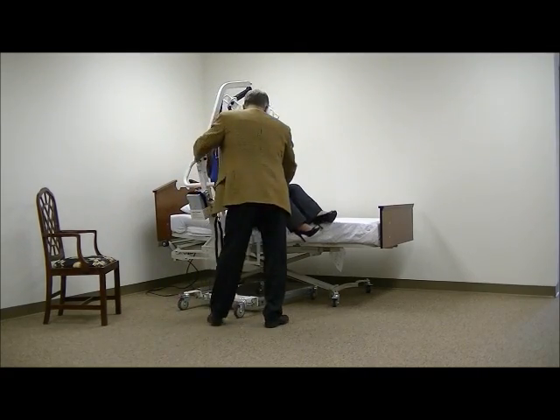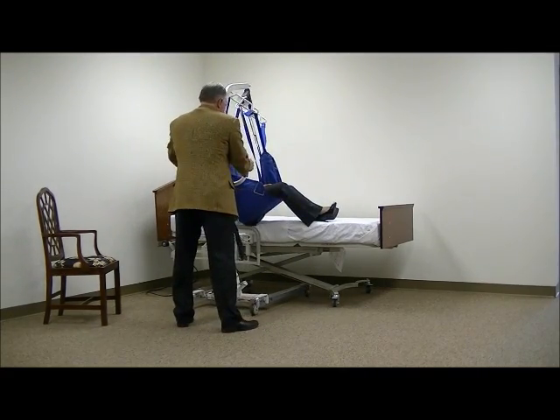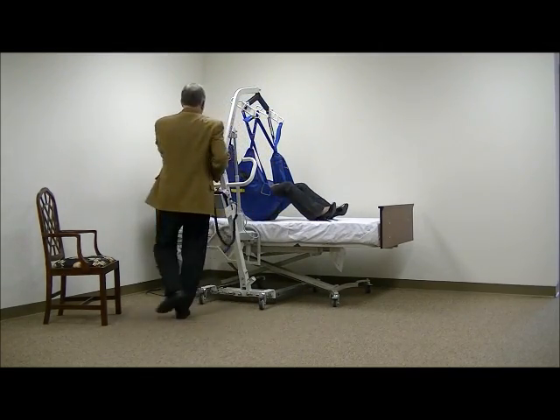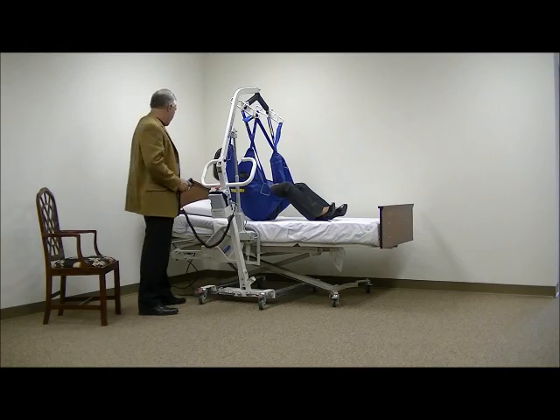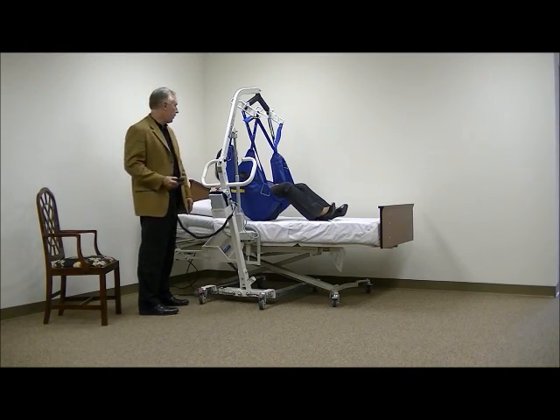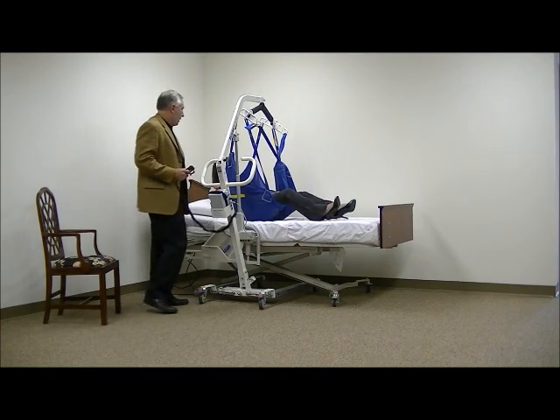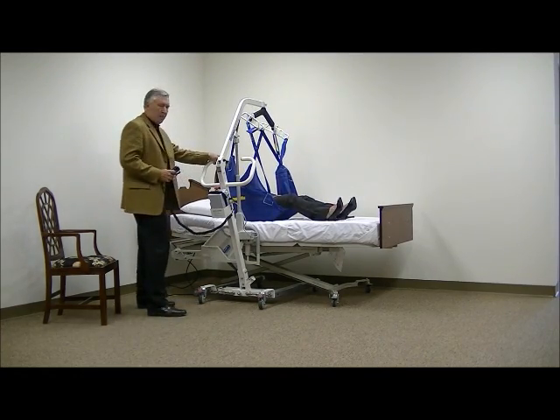Now you can see we take the patient over the bed. Pay attention to where the head and the bottom are going to end up so that you get the patient in the bed in the right place the first time. Hit your down button on your remote, and we should have our patient in bed in no time.